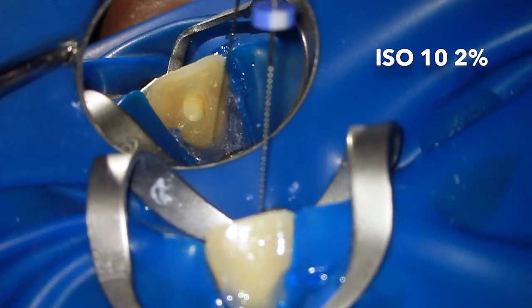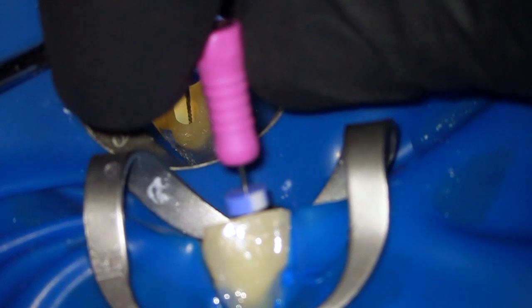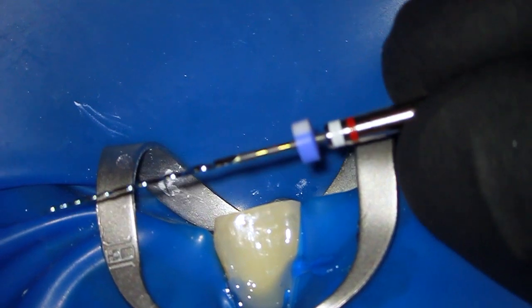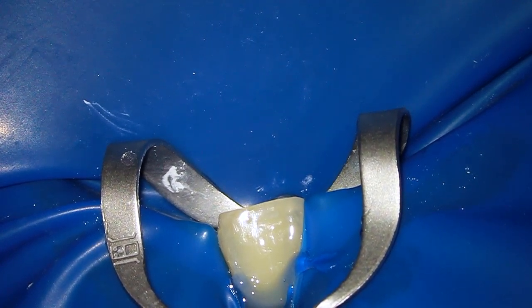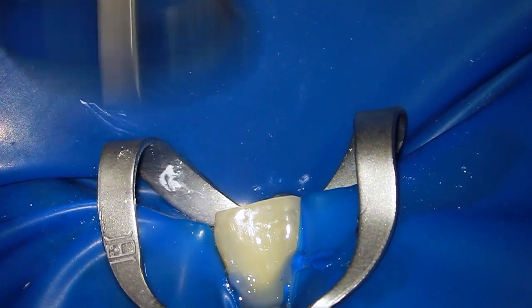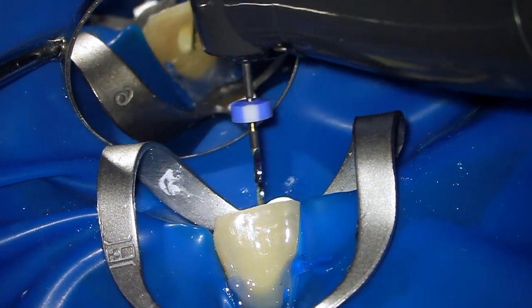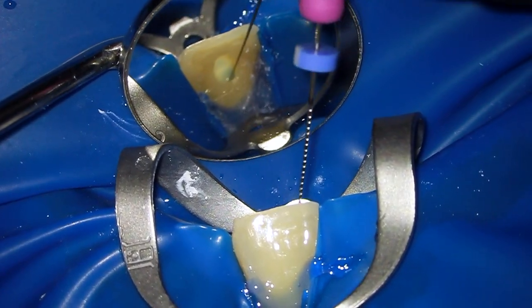The first step is to remove the temporary filling and clean the pulp chamber. Now we can create the glide path with the hand file in the size of ISO 10, 2% taper. Having the glide path established, we can proceed to the XP Endo Rise glider. Remember that irrigation between all files is a crucial part of every non-surgical endodontic treatment. Using the XP Endo Rise glider, remember about gentle strokes of 2-3 mm to reach the working length. Recapitulate to check the working length and to avoid clogging.